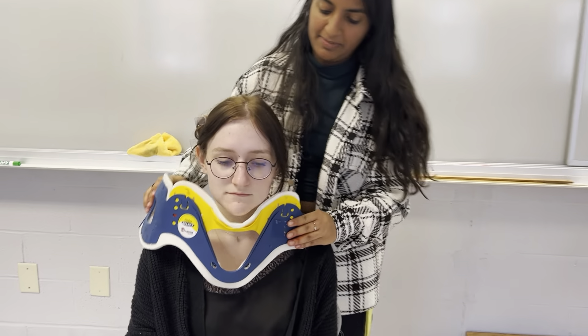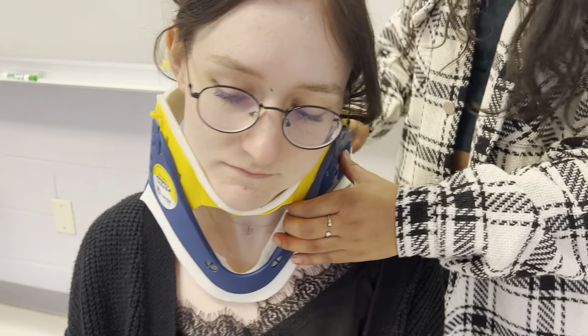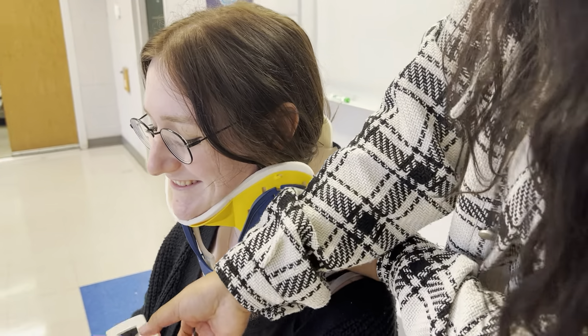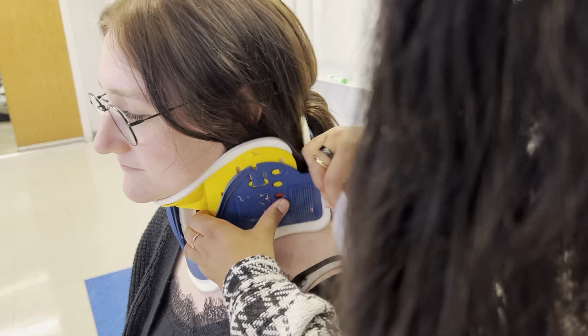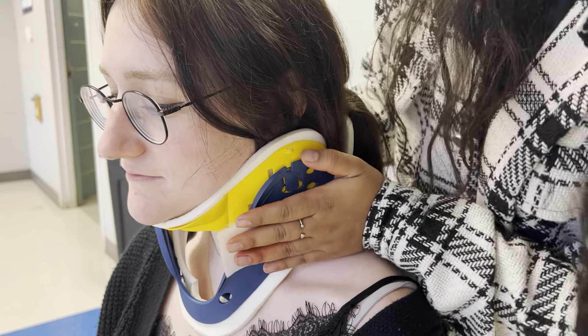Now I'm going to take my C-collar and put it on my patient. I'm going to have it nicely folded. And it should fit nice and snug with our patient. This is the proper placement of the C-collar.